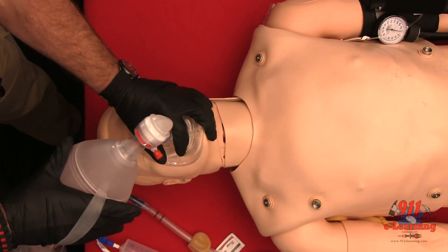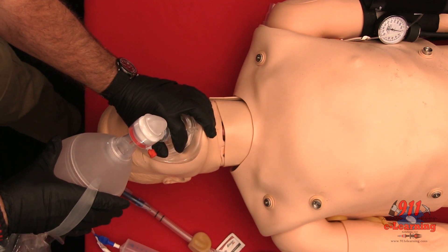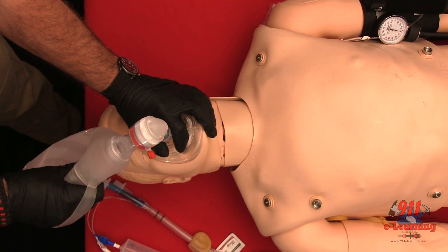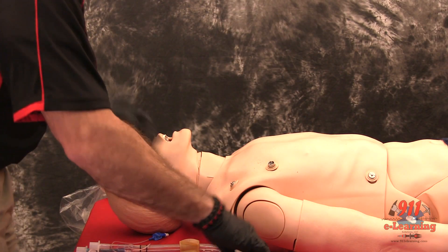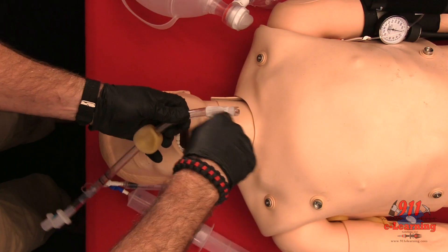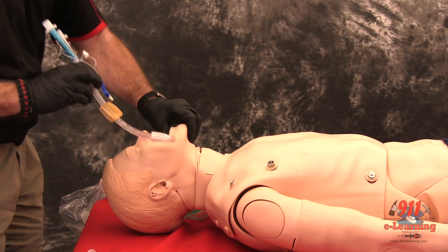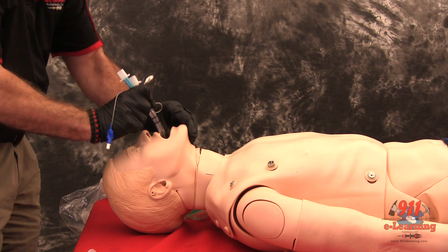Pre-oxygenate the patient. Lubricate the tube. Grasp the patient's tongue and jaw with your gloved hand and pull forward. Gently insert the tube until the teeth are between the printed rings.